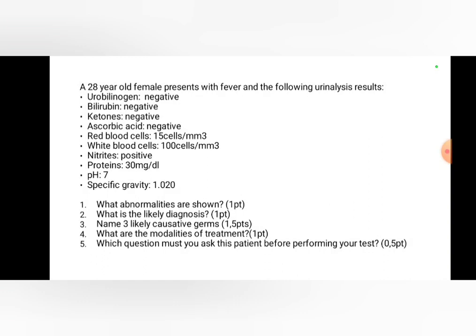Now the question that you are going to ask me is, why is there a proteinuria in this case? There is a proteinuria in this case because every time that you have hematuria, hematuria can result in a proteinuria. This proteinuria is not a glomerular range proteinuria because 30 milligram is either trace or 1+. Is it clear? When you have a glomerular range proteinuria, it is going to be more than 30 milligram, at the level of 100 milligram per deciliter. I hope you're understanding where I'm trying to move to.